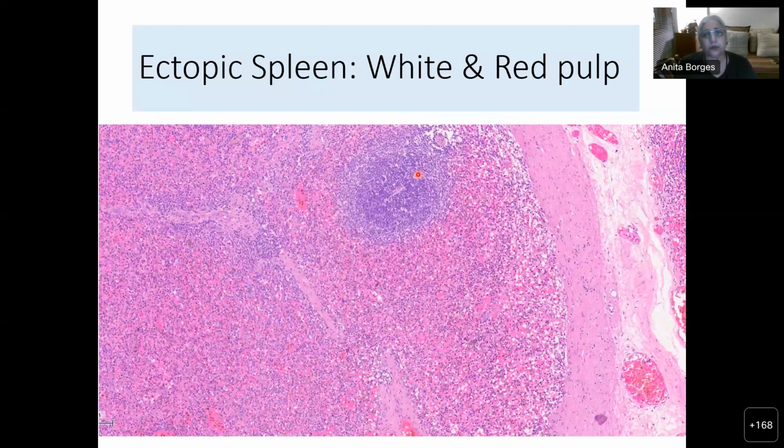It's an ectopic spleen. And now you can see it's such a beautiful spleen, actually. Look at this capsule. There is no subcapsular sinus. I know that the spleen has lots of sinuses, but it doesn't have a subcapsular sinus. And what were these, what we call the white pulp? What were these little follicle things? You notice that there is an arteriole which has penetrated into the center.